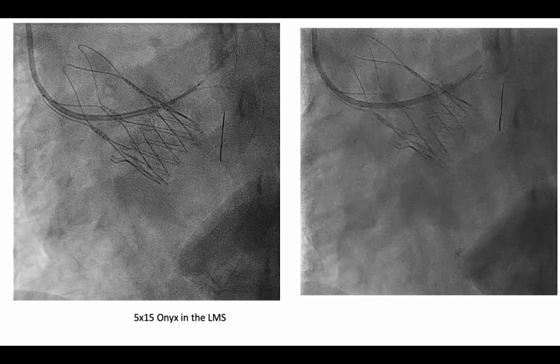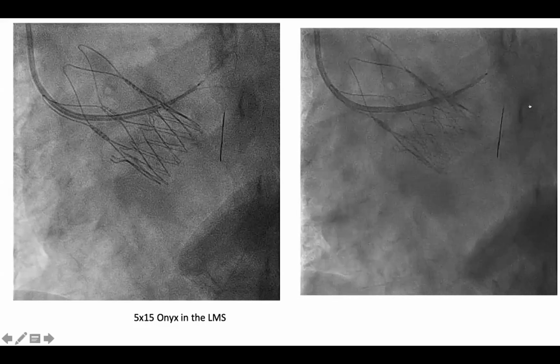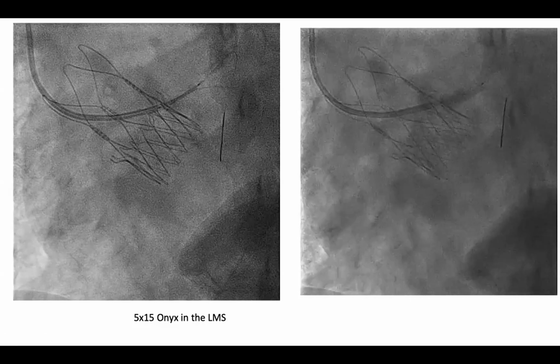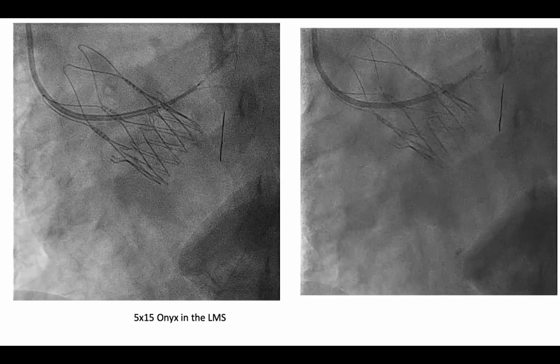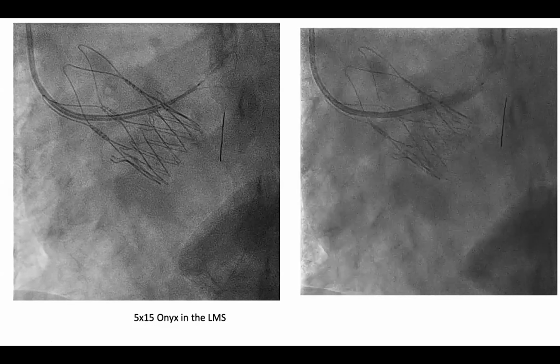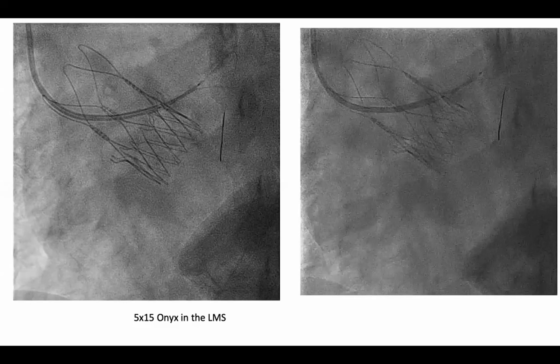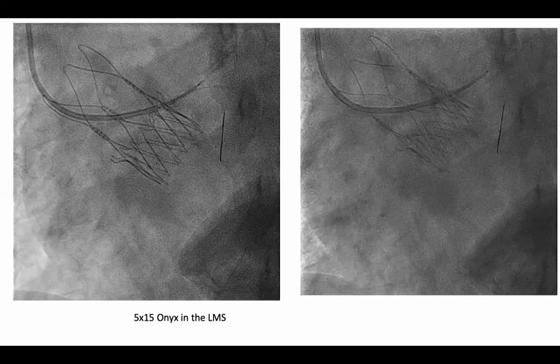I have a case, if you allow me. I guess the question is, are you talking about access to the vessel, or subsequent support as well? Judkins guides are great for getting access to the vessel, but I have to say I found that unless you're 7 French, support further on down the line is a little bit tricky. You're absolutely right, they won't give you the support. However, what is most important is getting to the coronary, and for that the Judkins catheter is much better, especially through the TAVI valves.